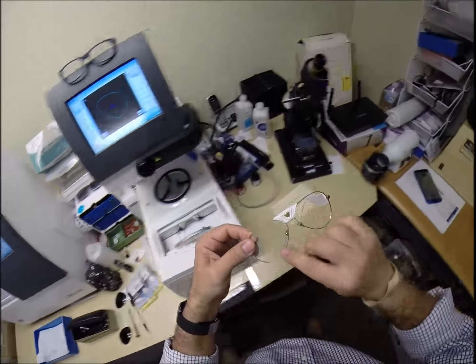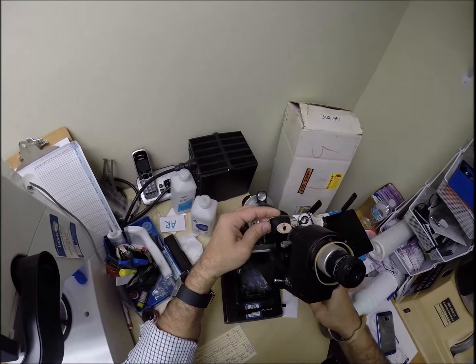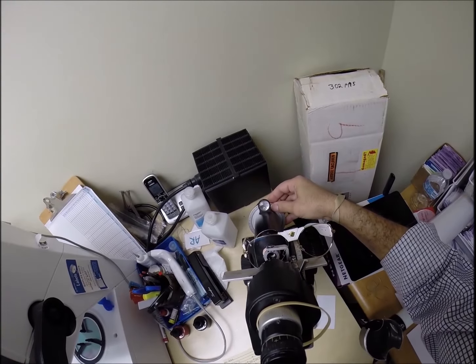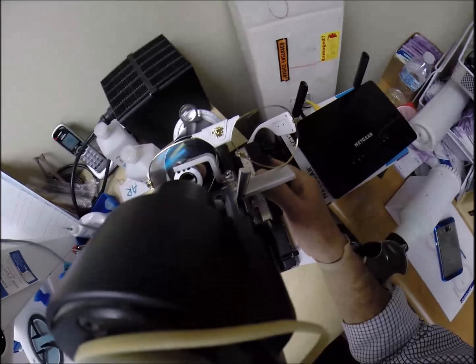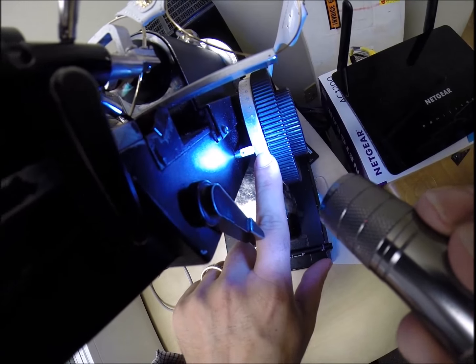We're going to come down to the lensometer. I'm going to measure your prescription right in front of that black dot, which will be right in front of your pupil. Turn the fine tune knob back to 165. Check the power, and I am getting, if I can find my flashlight, +1/4, 1 tick mark away from 0.